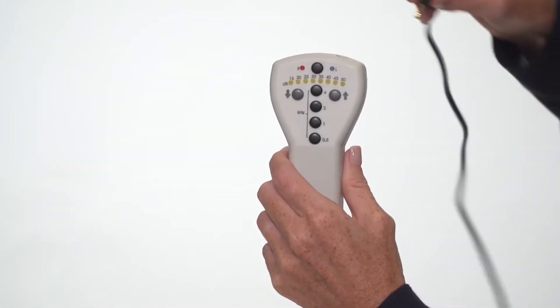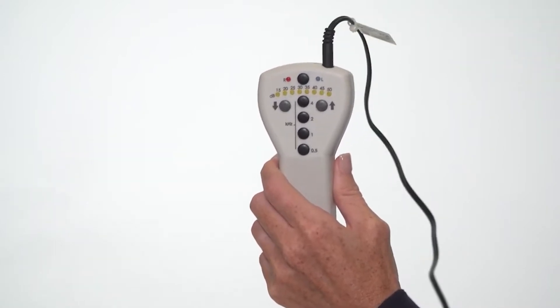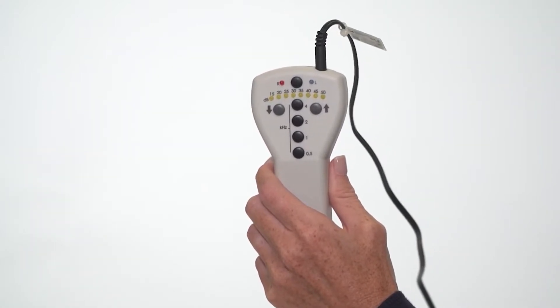Before using the device, plug in the headphones by plugging in the single jack into the top of the device. Ensure the plug is inserted and fully seated into the jack.